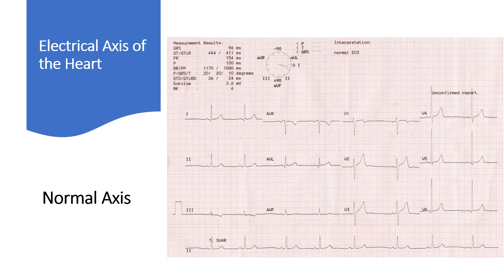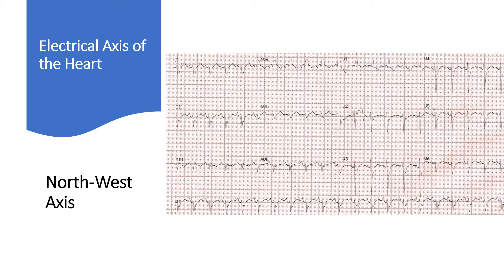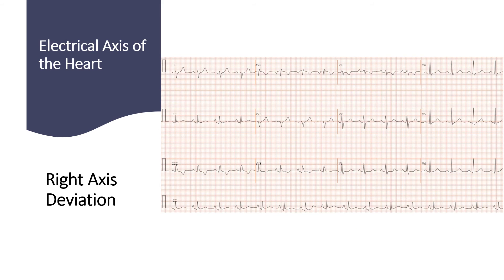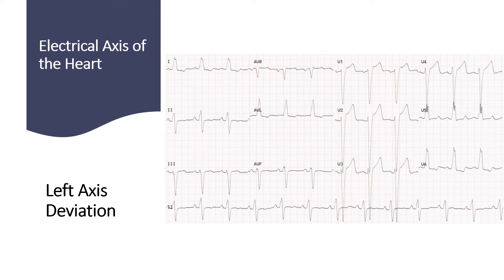An ECG showing normal QRS axis with both lead 1 and AVF positive is shown, with right bundle branch block and sinus tachycardia also present. An ECG showing right axis deviation is presented; in addition, there is right bundle branch block with very wide QRS and ectopic atrial tachycardia with 2-to-1 conduction. Another ECG with right axis deviation shows QRS in lead 1 as negative and that in AVF as positive. An ECG showing left axis deviation presents positive QRS in lead 1 and negative QRS in AVF, with left bundle branch block also present.